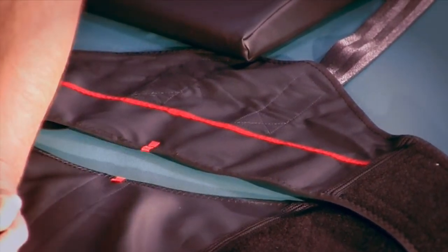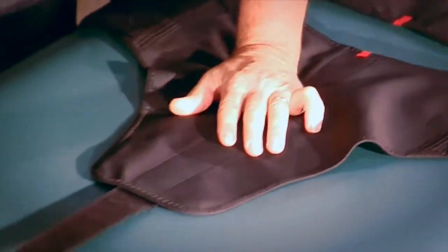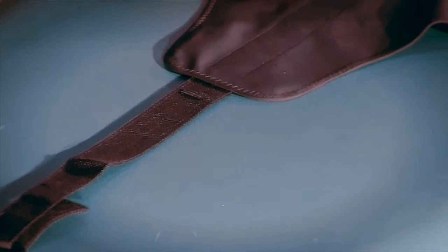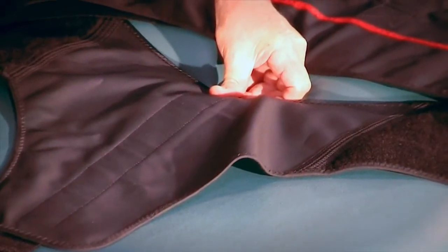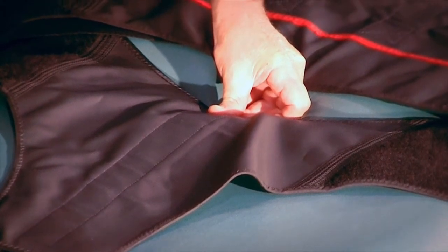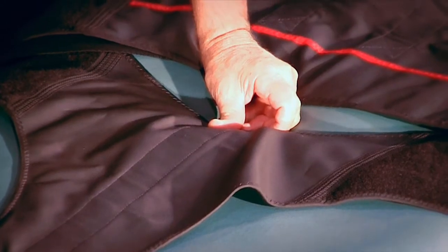We're able to adjust this length of the hook, where the hook goes in, and that puts this right here. That is really a one-time adjustment, but this will fit any traction table. We haven't found a traction table it won't fit yet, so it doesn't matter who your manufacturer is — we put a better belt on.